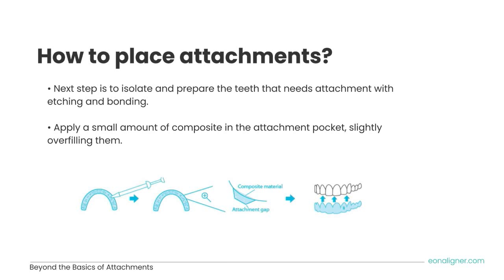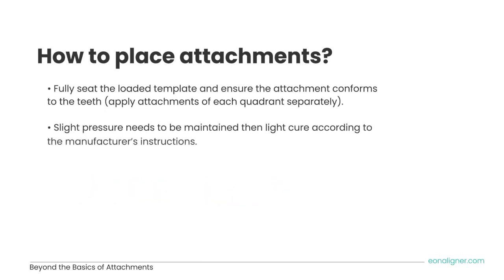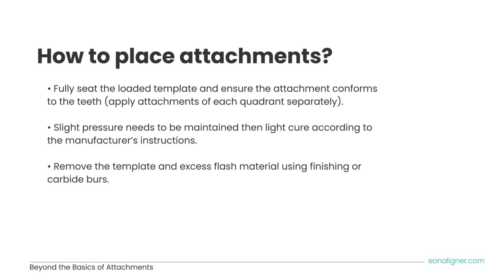A useful tip is to apply a very light coat of petroleum jelly in the attachment pocket prior to placing composite. This will assist in easier removal of the attachment after composite is fully cured. Fully seat the loaded template and assure the attachment conforms to the teeth.